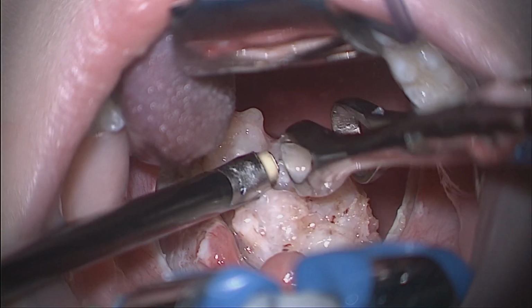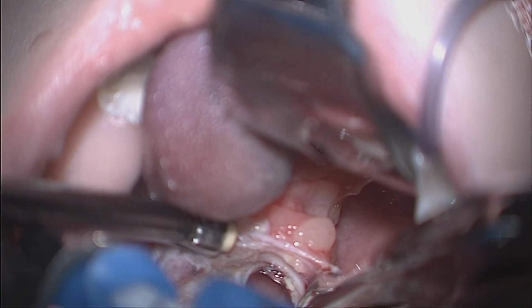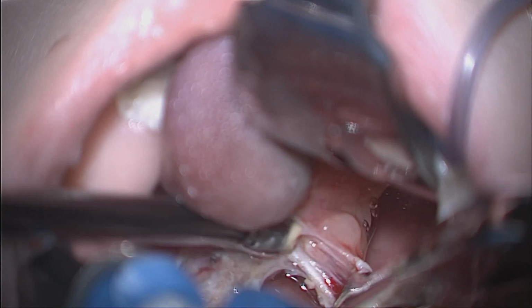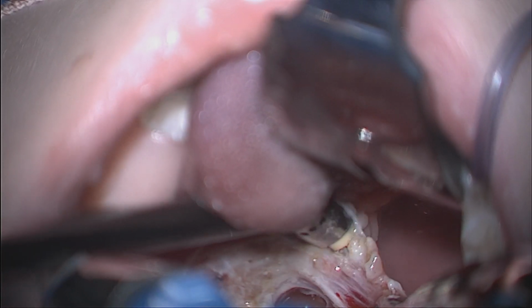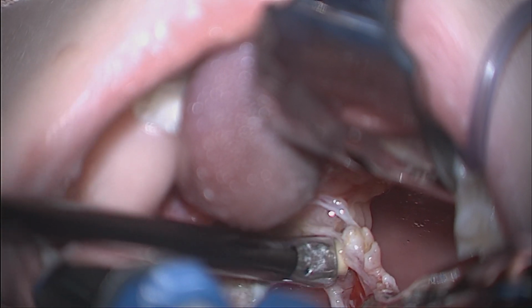Particularly when approaching the inferior pole, the position of the microscope may need to be adjusted in order to optimize the view. This is one slight disadvantage of using the microscope, as it requires the surgeon to be cognizant about optimizing their view and have a low threshold to adjust the view as necessary. Whereas with a headlight, the surgeon can very easily shift their perspective intuitively and without interrupting dissection.